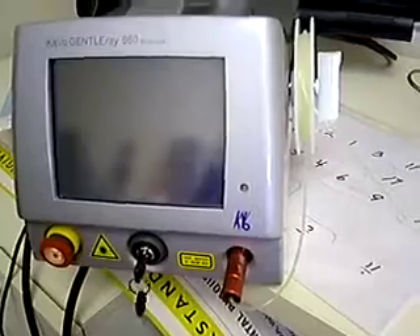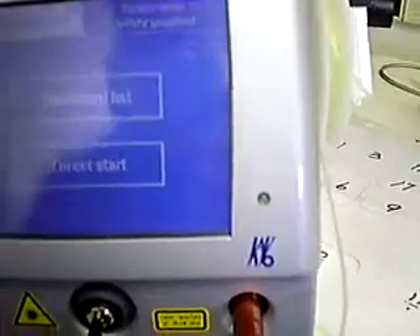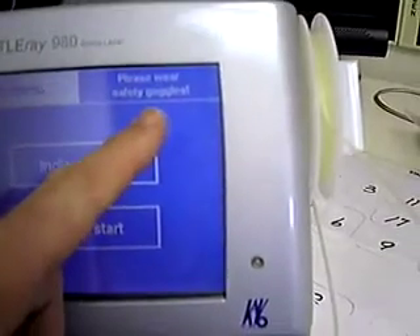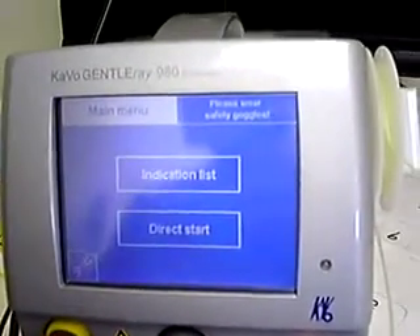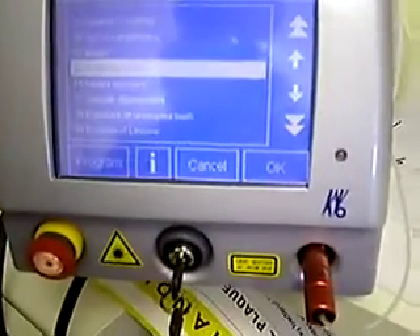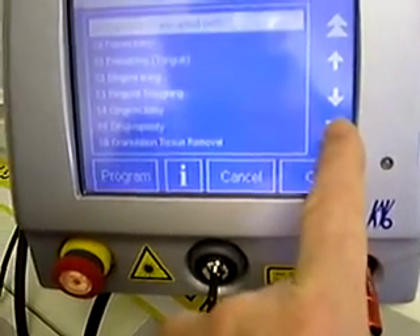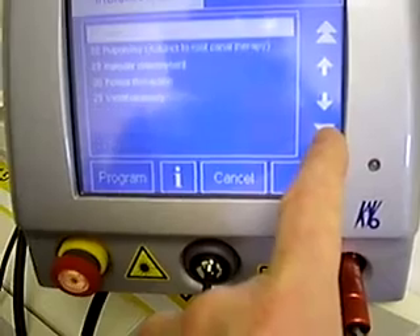Just turn the key and that engages the laser, and you get a nice screen that comes up where you can do a bunch of different things. We're going to start with the indications list, but most importantly it lists a warning: always wear your safety goggles whenever you're using a laser. Especially if you're wearing loupes, you need inserts in order to protect your eyes.